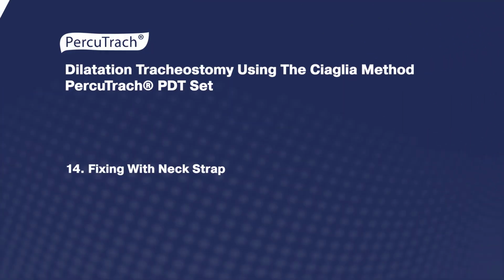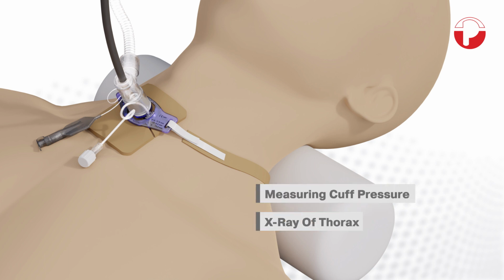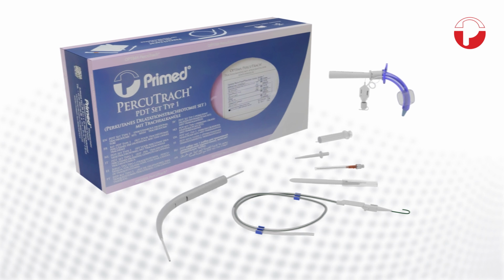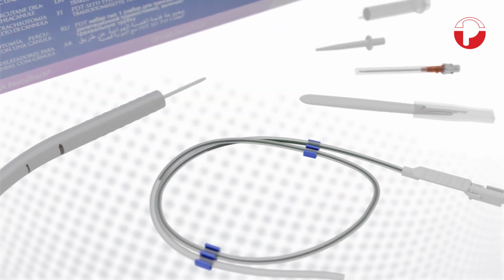If the tracheostomy tube is positioned correctly, a tracheal compress should be used and a neck strap applied for fastening. It is a good idea to check the cuff pressure with a cuff pressure gauge and to take an X-ray of the thorax. The PercuTrach PDT set for stepless dilation is available in various versions.